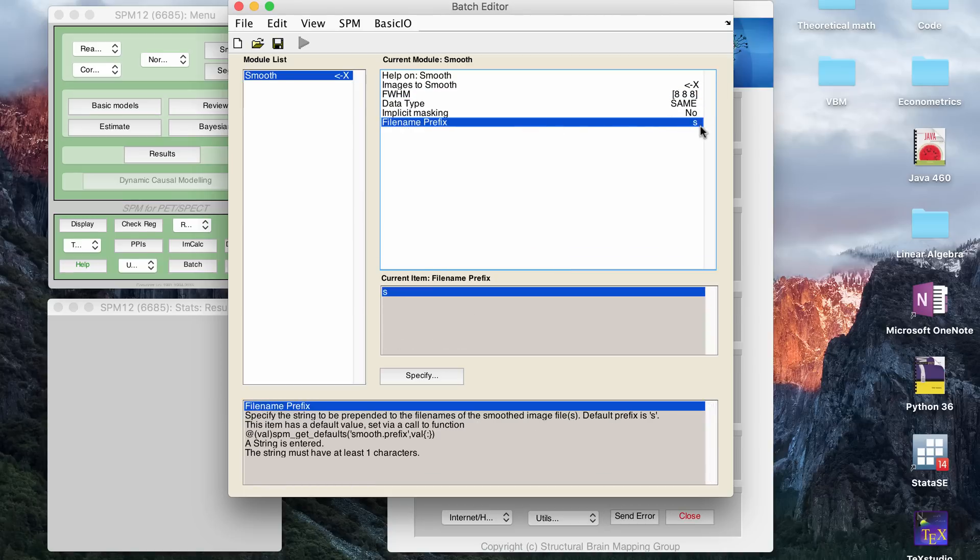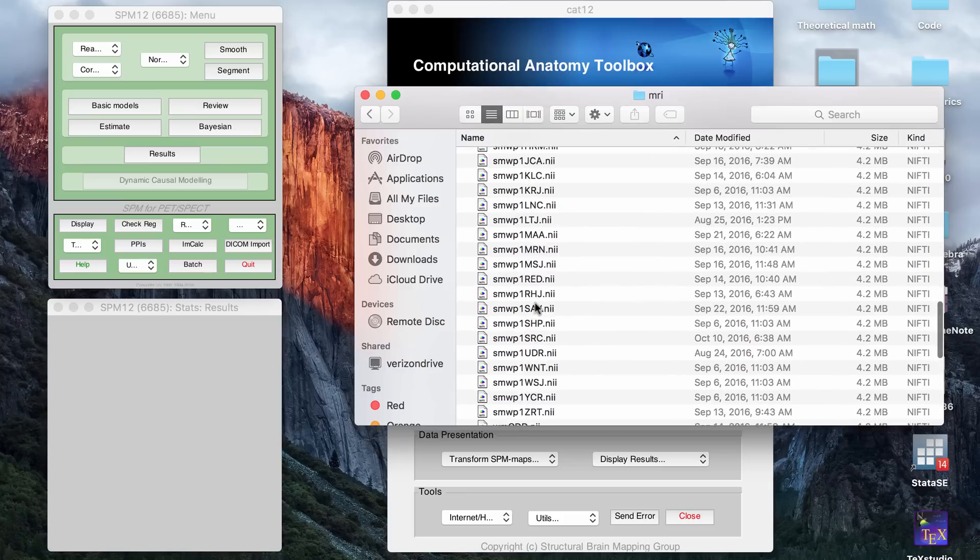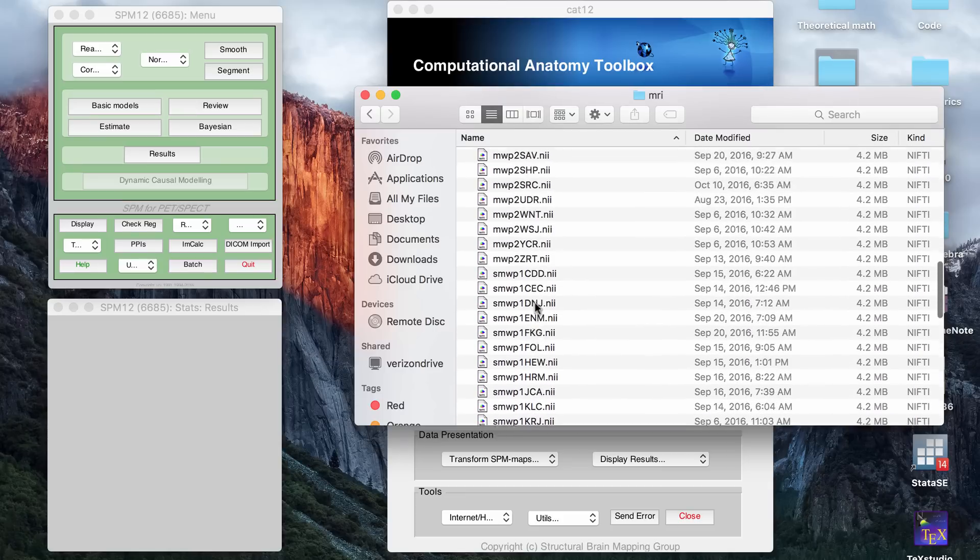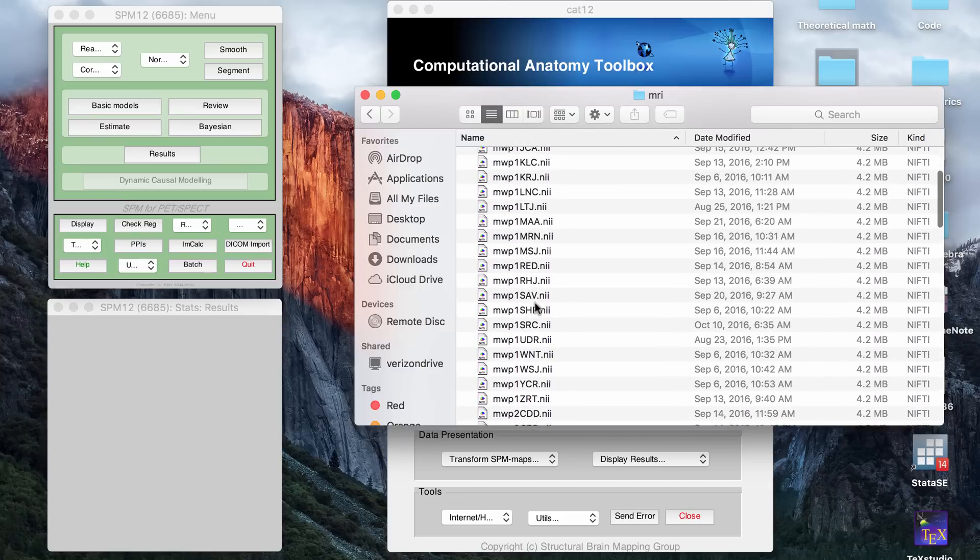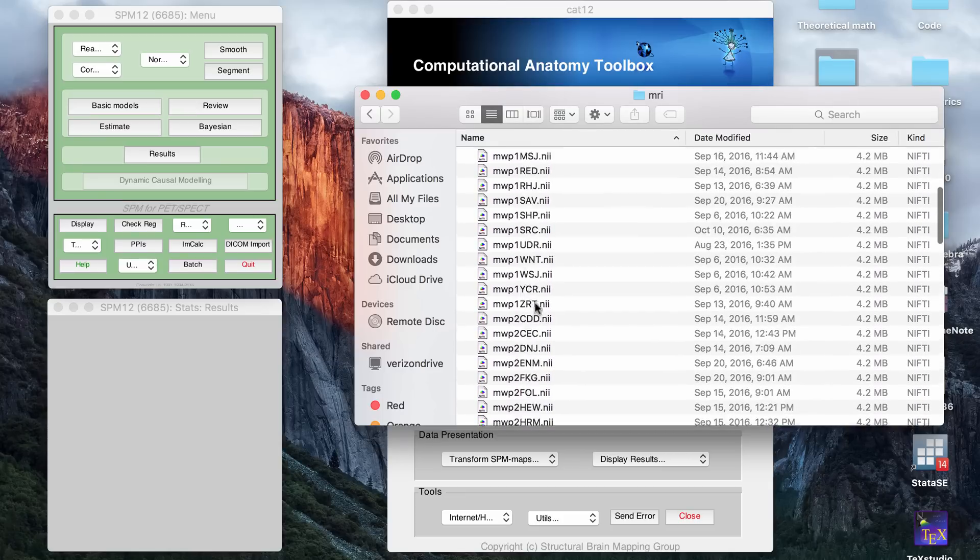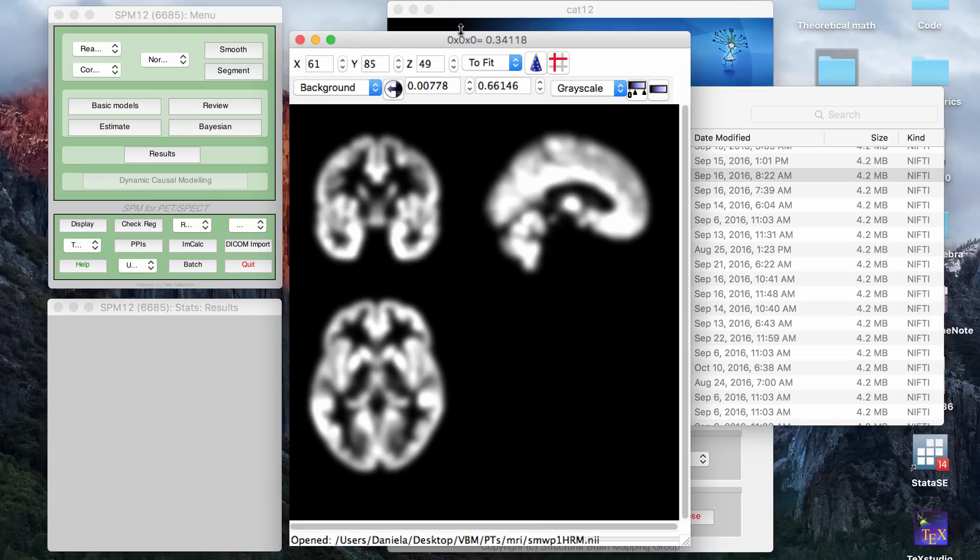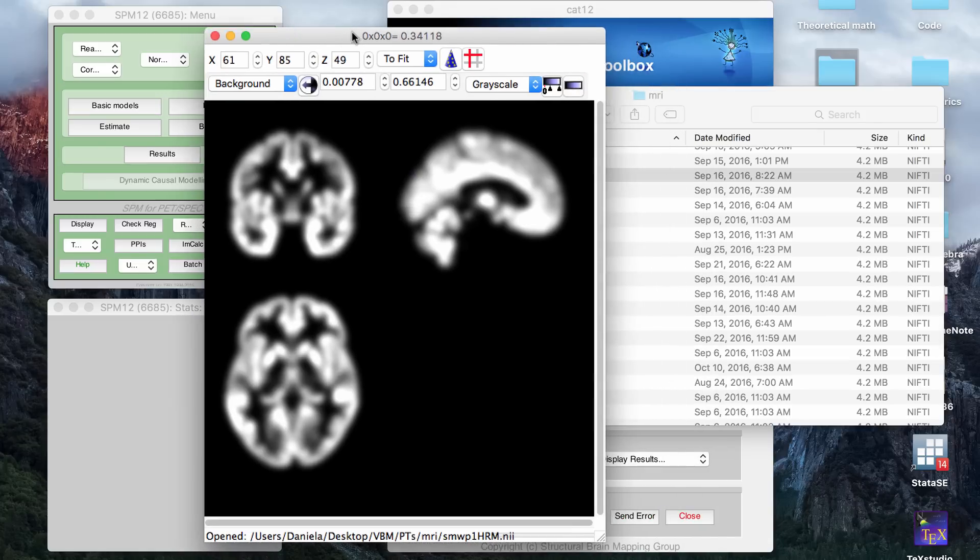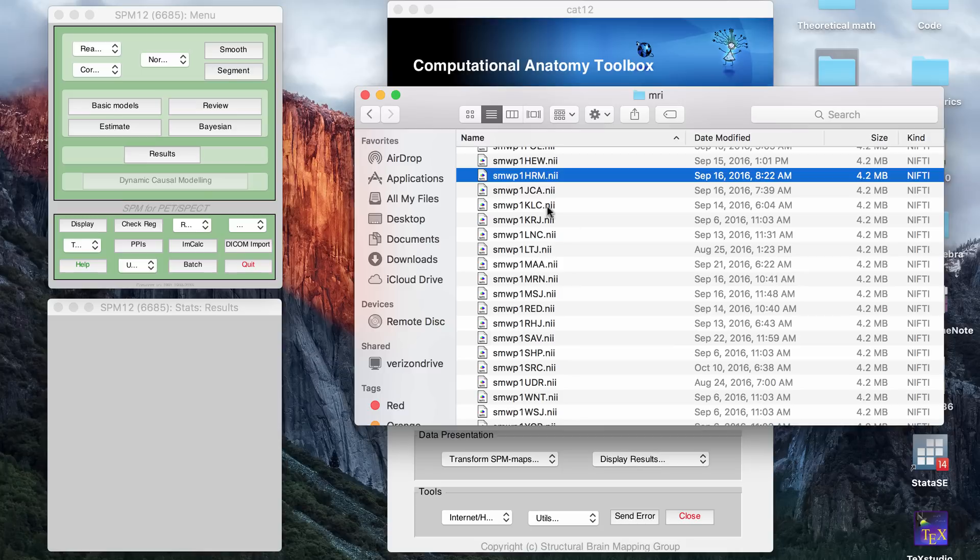This, for example, will tell you that it's appending the letter S to the files once it's smooth. So after you run this in your MRI folder, now you're going to have smoothed, so SMWP1 files. So if you click it now, you're going to see, and this is with an eight millimeter smoothing kernel. So you have the smooth gray matter files for all your patients and all your controls.